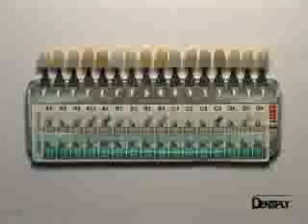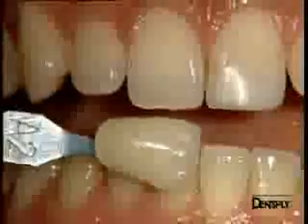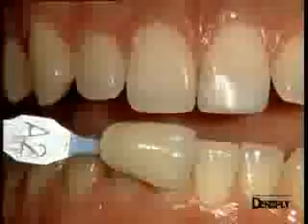The choice of shade is made using a Vita shade guide, from which it is evident that the A2 shade corresponds to the situation. The composite system chosen, namely the nanoceramic restorative CeramX Duo, provides its own shade system, with a recipe for all the Vita shades.